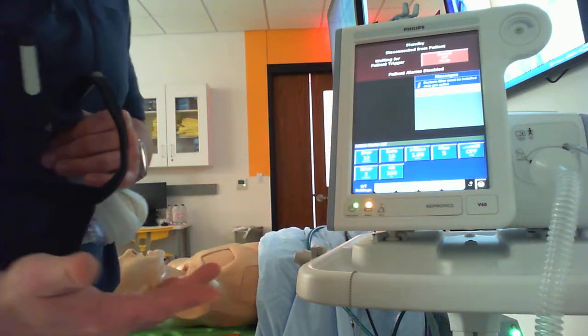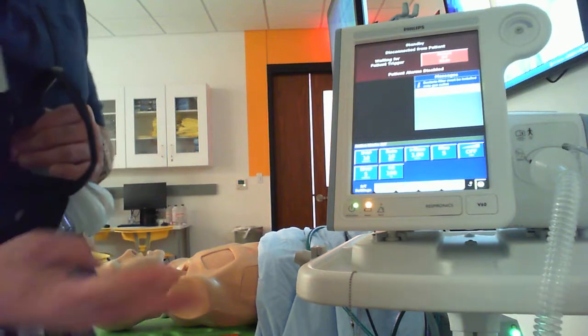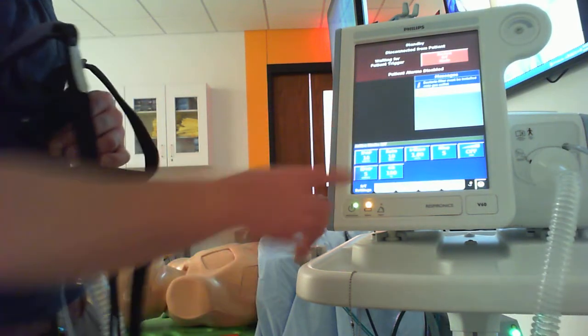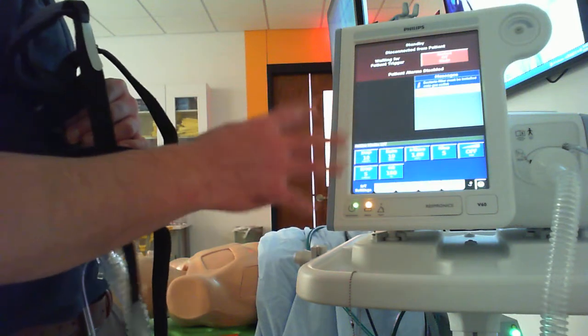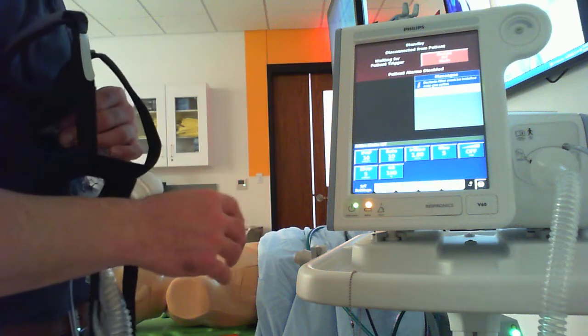This respiratory rate should never really play a part unless the patient has trouble triggering, so a leak, auto PEEP, something along those lines. It's meant as a backup so we can make adjustments. We don't use this like an invasive ventilator typically in making rate changes to fix somebody's work of breathing or blood gas or something like that.